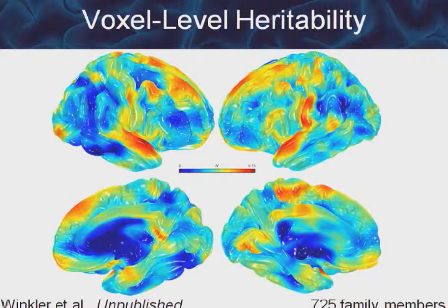We also did this before I knew that Peter was working on routines to do so. So it is possible to go in and run a voxel level analysis. In this case, each of these is a vertex, and the heritability estimate is telling you the heritability we got for that vertex based on a T1 weighted image in the cortical thickness, right? So I'm showing you heritability estimates. In this case, it's ranging between 0 and 0.75.